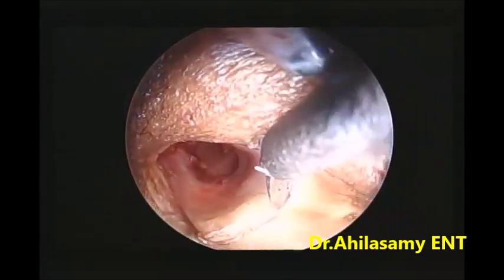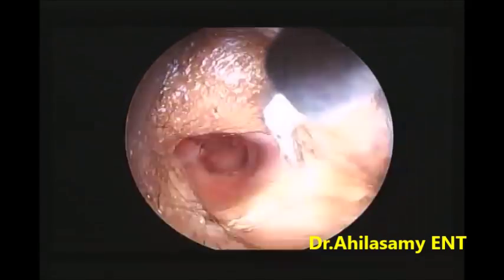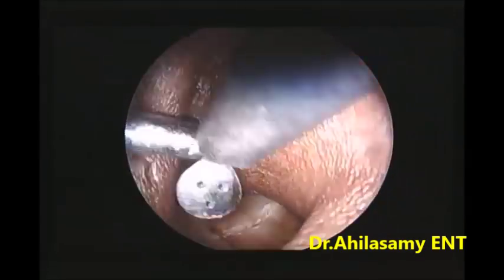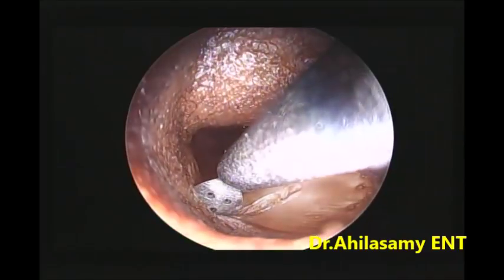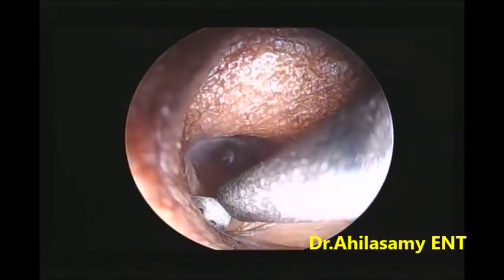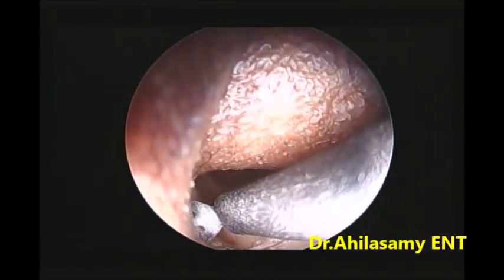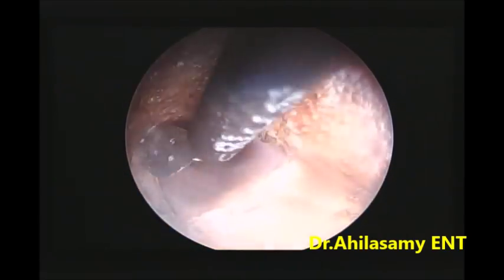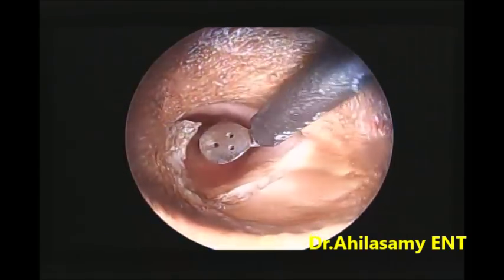First, you make an incision on the desired area — 6 millimeter or 8 millimeter depending on your preference or the particular case. This case is being taken under local anesthesia after canal infiltration, and the edges of the perforation have been freshened.